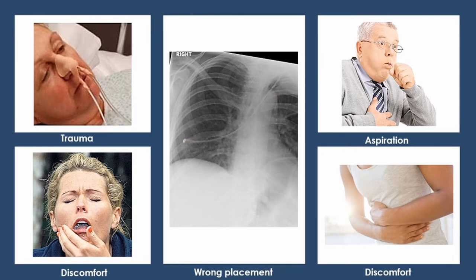Other complications of NG tube insertion include abdominal cramping or swelling from feedings that are too large, diarrhea, regurgitation of the food or medicine, tube obstruction or blockage, tube perforation or tear, and tubes coming out of place and causing additional complications. So those are your risks and complications.